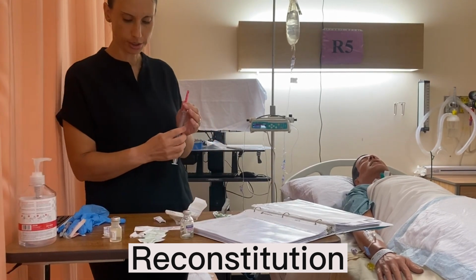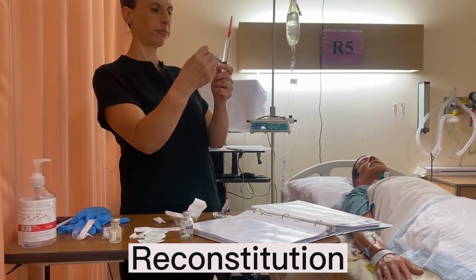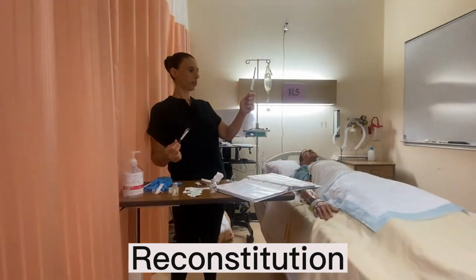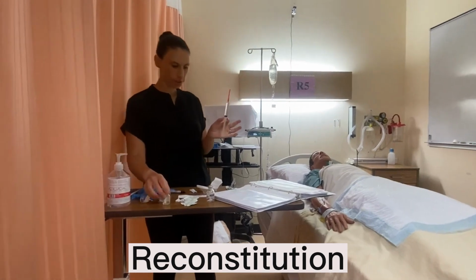Scoop and swoop there. And then we're going to tap out the bubbles. There we go. Good. And then we're going to make exactly 10 mLs of our sterile water.